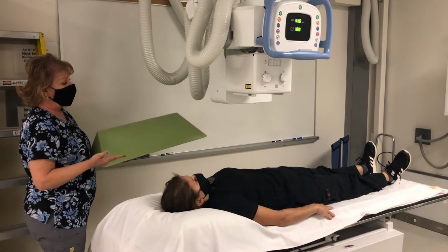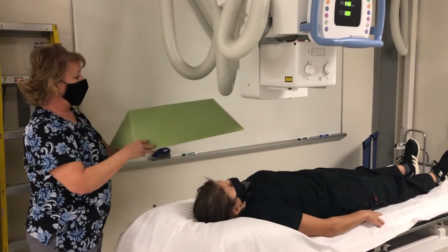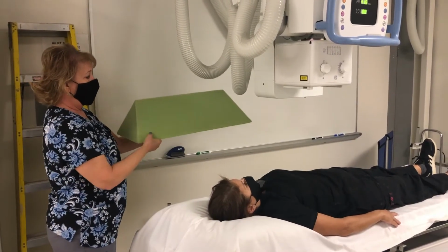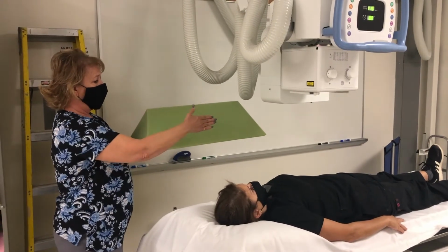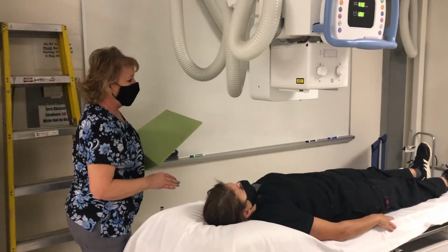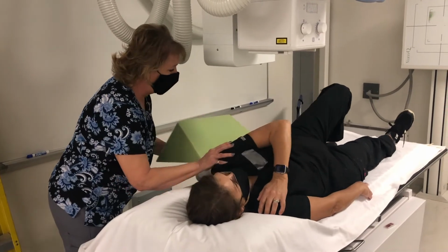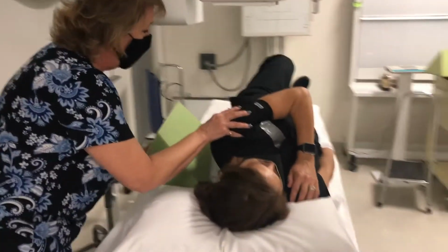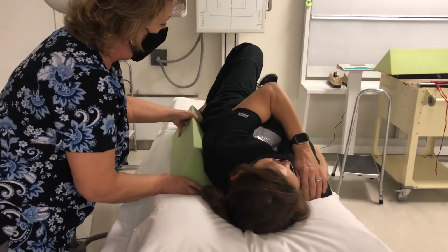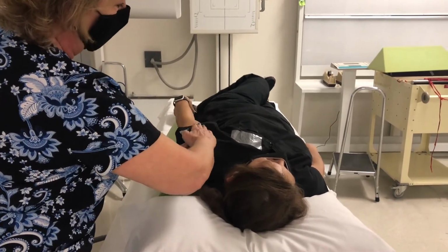I'm only gonna roll her about 30, so instead of having her roll up all the way to the side and putting this under so that she rolled back and was at 45 degrees, I'm gonna put it like halfway under so that she rolls back farther and she's only about 30 degrees. So what I need you to do is bend your left knee, cross your left hand onto your right shoulder, roll away from me just a little. So instead of putting this all the way under her back, I'm just putting it about halfway so that when she rolls back, she's not quite at 45, she's more like 30 degrees.